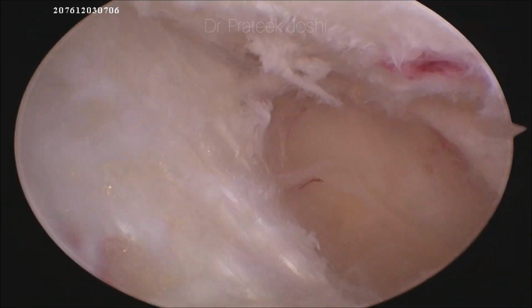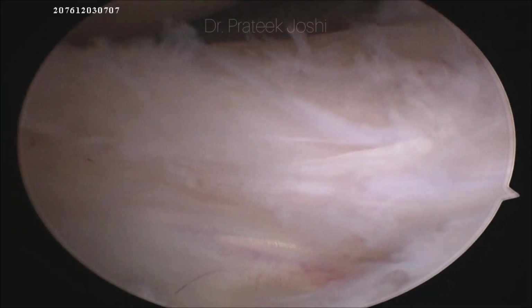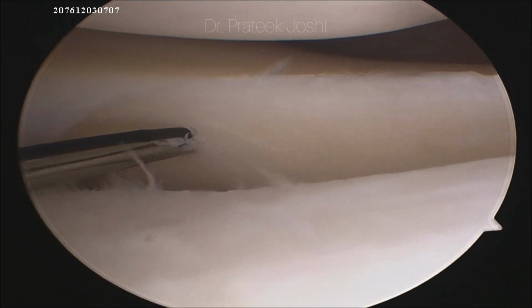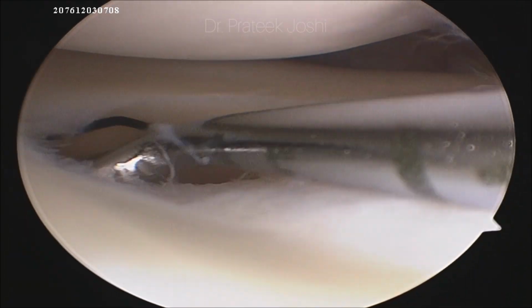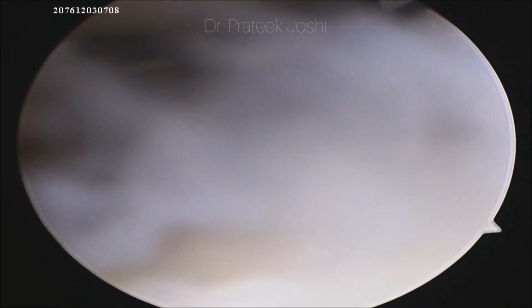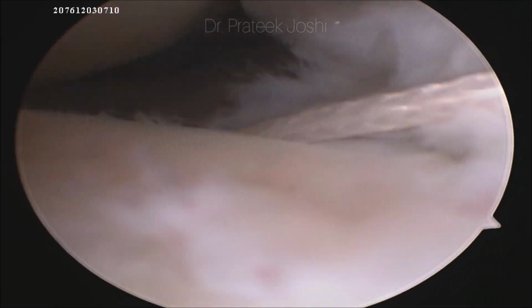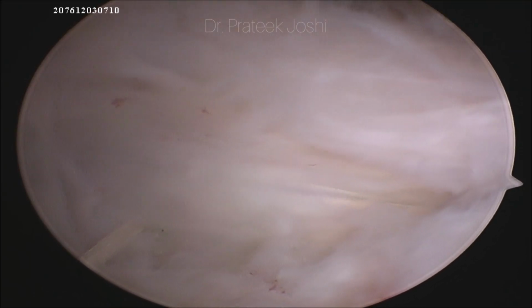In such anterior tear of the meniscal tissue, the outside in technique is ideal to repair the meniscus tear. So here I am going to pass a loop of number 2 ethilon through the tissue of the meniscus. I am going to take the medial most suture through the substance of the anterior horn of the lateral meniscus, and through this loop of the ethilon I am going to shuttle number 2 fiber wire, and again I am going to repeat this step to complete the horizontal mattress suture configuration for meniscus repair.